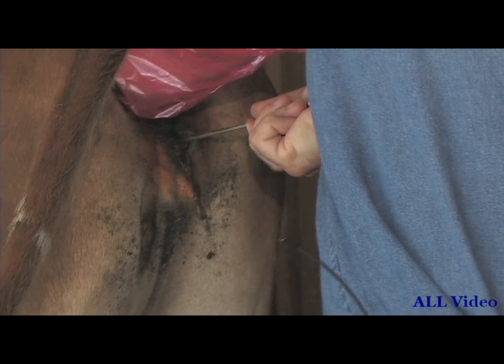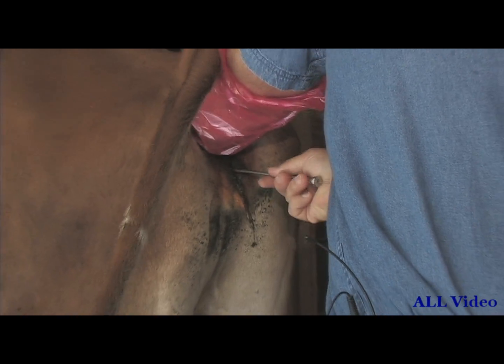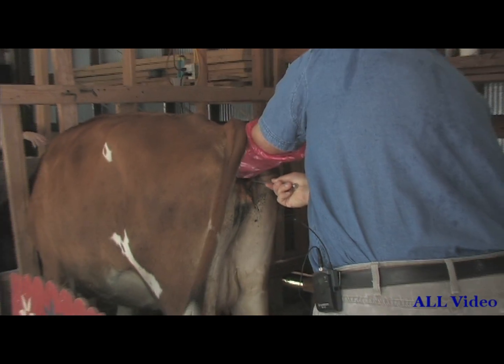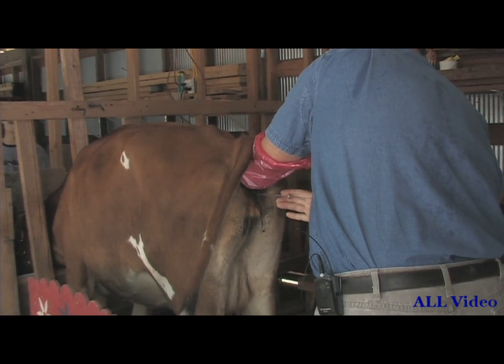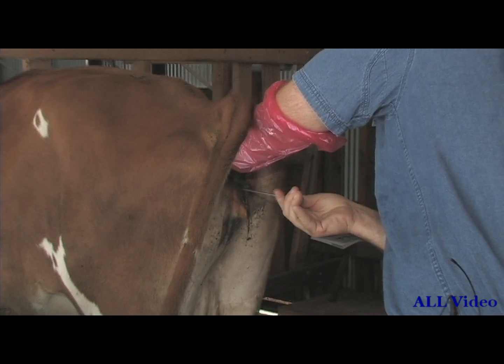This is the first cow I ever inseminated and she got bred the first time I did it. I think I'm there — the best I can tell. I'm going to push the plunger in now; this is where it's seaming in. And just back out. And that's it. Put this back out. All right.